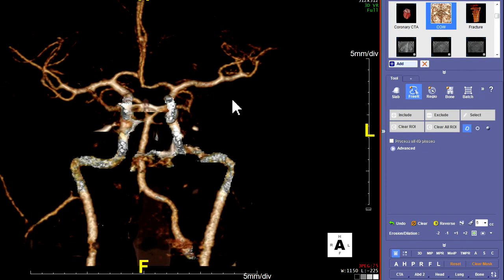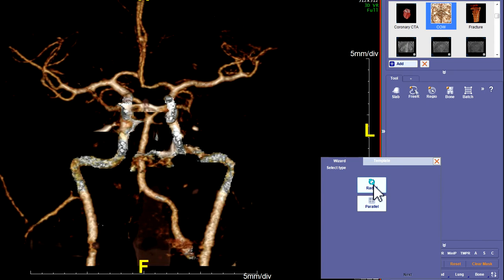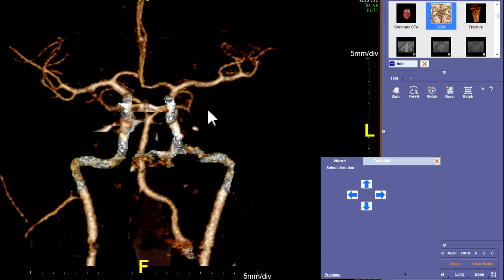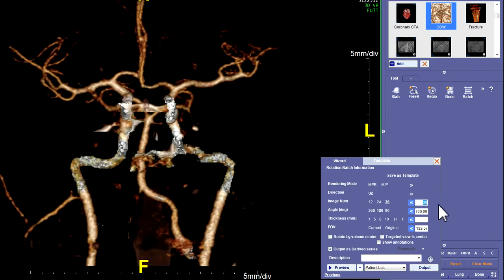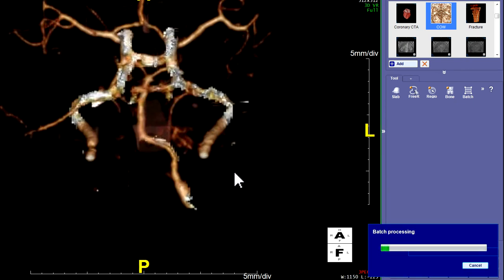You can get to it by hitting F8, or you can right-click and say batch wizard. Click batch wizard, and then you get this. Click the one that says radial, and then always start from the anterior view for these batch wizards. Be sure you have these numbers filled in: 36 steps, 360 degrees, and hit the current field of view so it doesn't shrink them. You can send it to the patient list and give it a name — this would be 3D COW without bone — and then hit preview to make sure it stays on there, then go to the output.